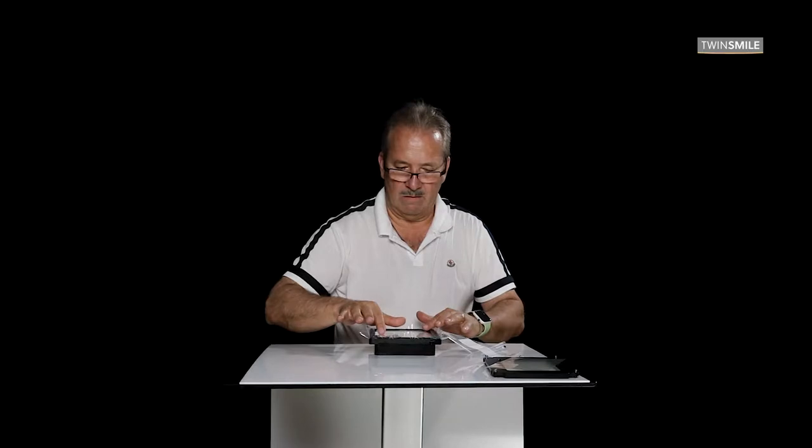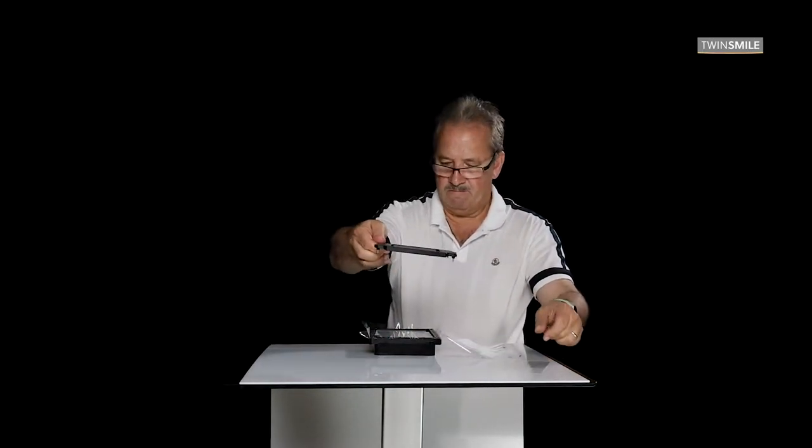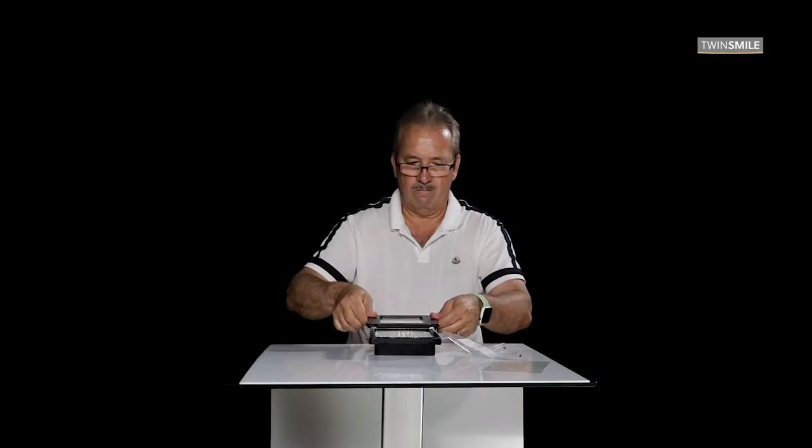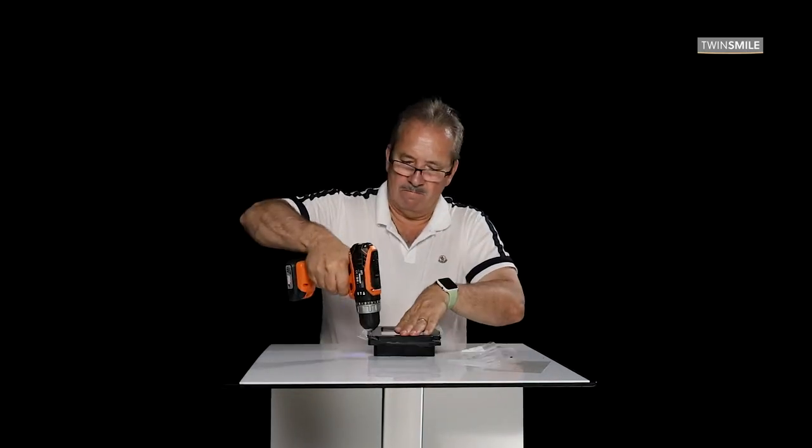Now you can put the glass bottom back onto the frame and screw it down with the four screws you had removed earlier. Be sure that you have no fingerprints from underneath or in between the Teflon foil and the glass bottom. It is important that there is no dust or any unwanted small objects blocking the light going through the VAT tank.